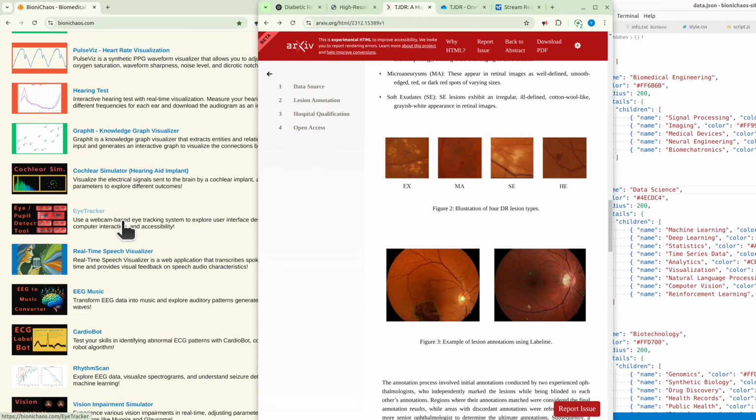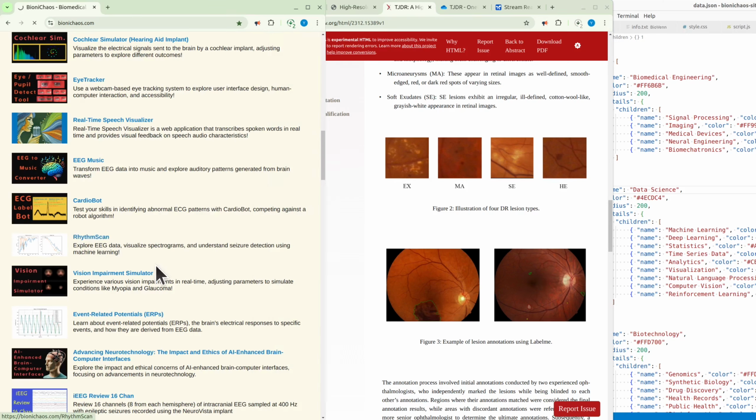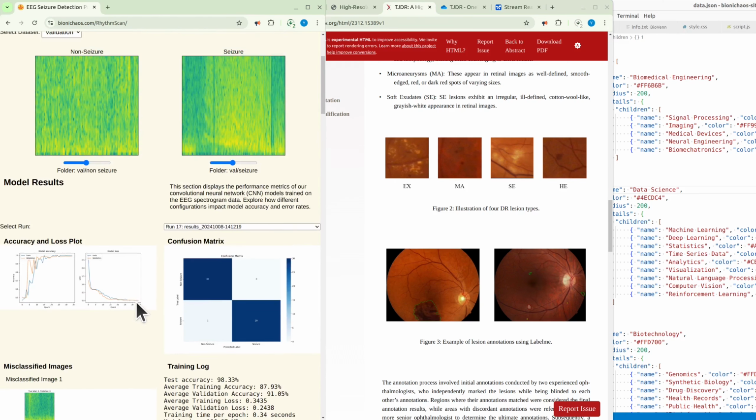It would be going over it and telling you, okay, in this case there is 90% similarity to the features in this sample, which is some sort of abnormality in the diabetic retinopathy, and then it will do a label on your image.